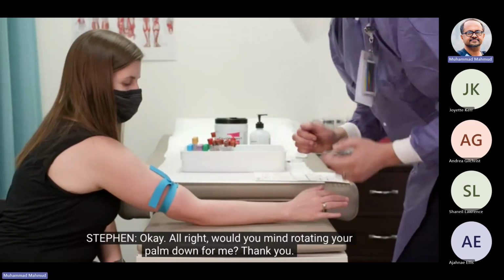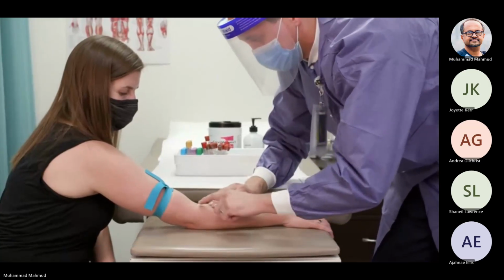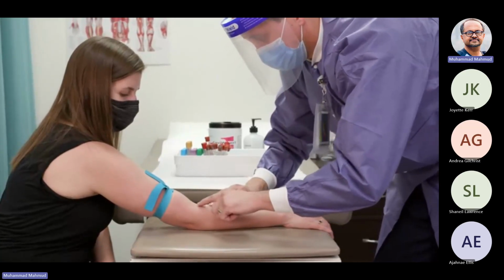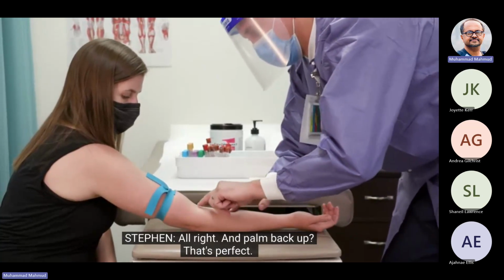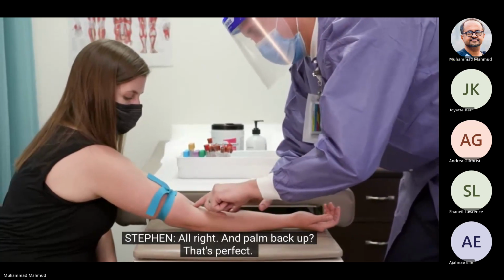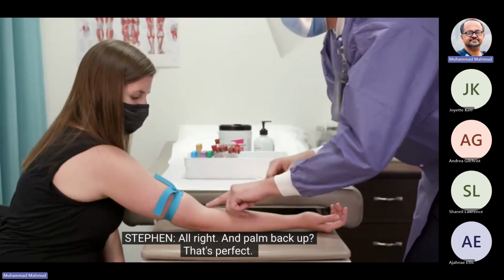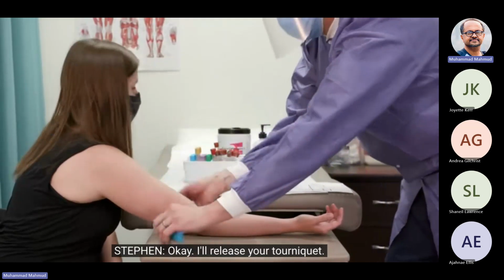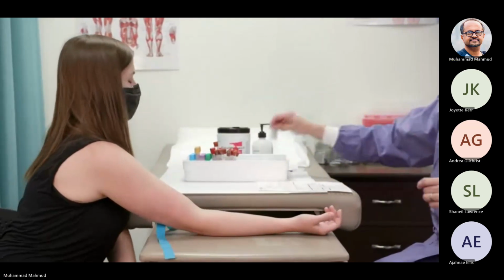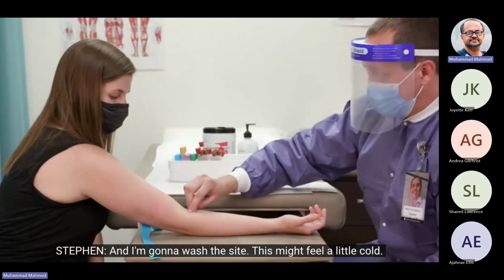All right, would you mind rotating your palm down for me? Thank you. All right, and palm back up. That's perfect. Would it be okay if we went right here? Sure. Okay, we'll release your tourniquet. And I'm going to wash the site. This might feel a little cold.